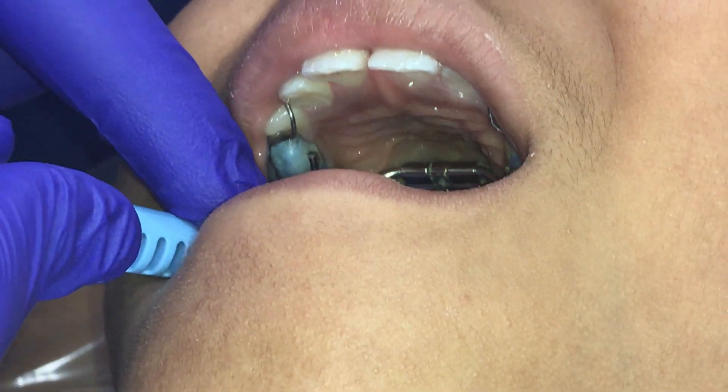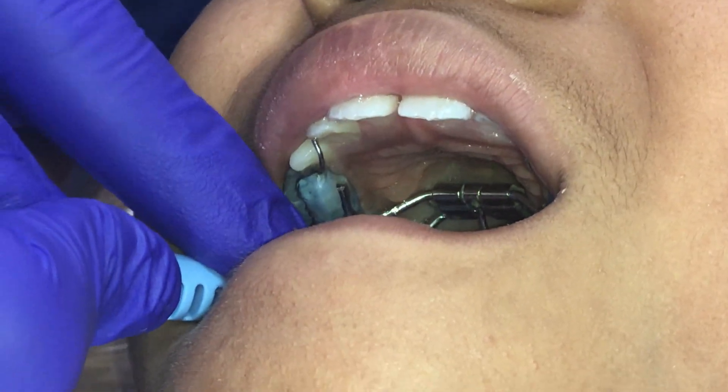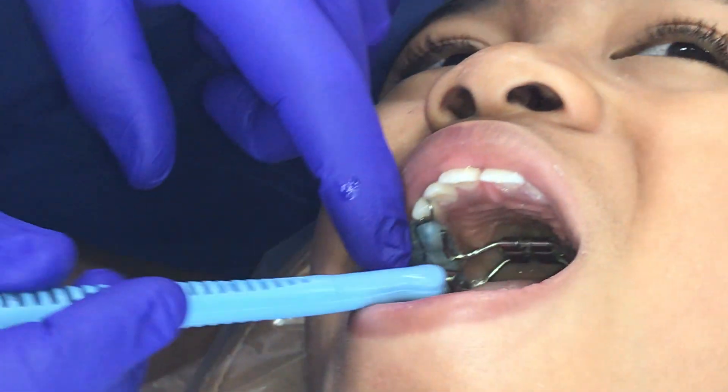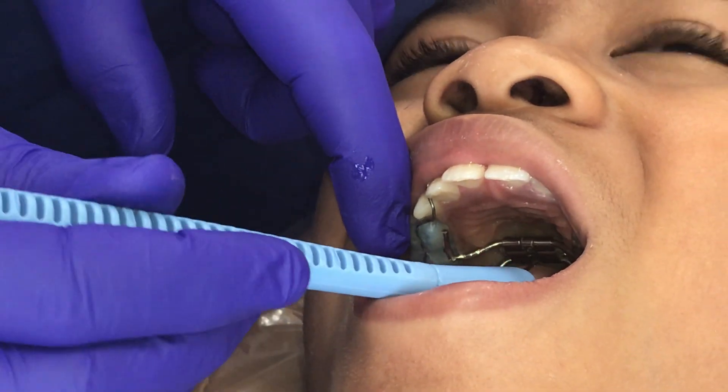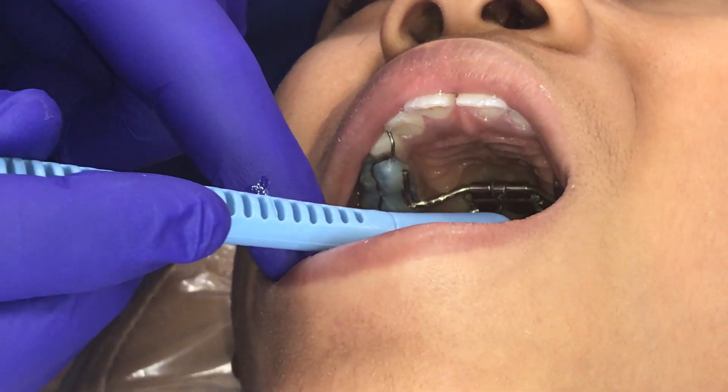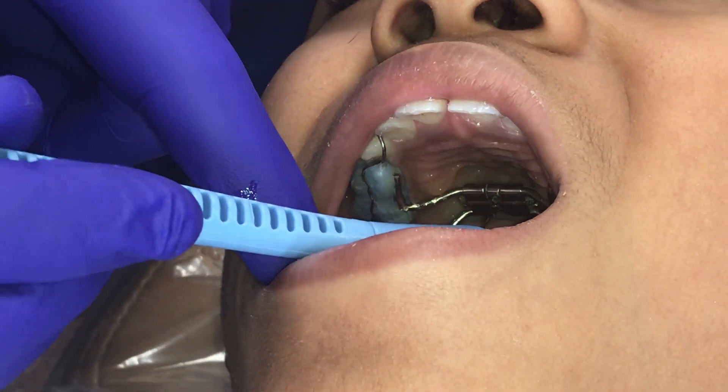There's a little food in the hole right now so it's a little hard to see, but once I get rid of the food you'll see it. Tip your head back, open wide — okay, now you can see that hole in the front right there. You're going to do that twice a week.